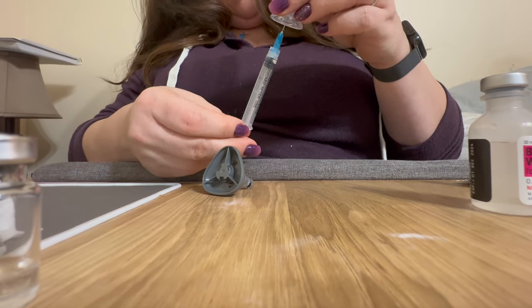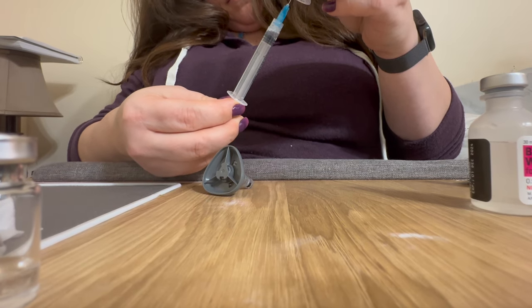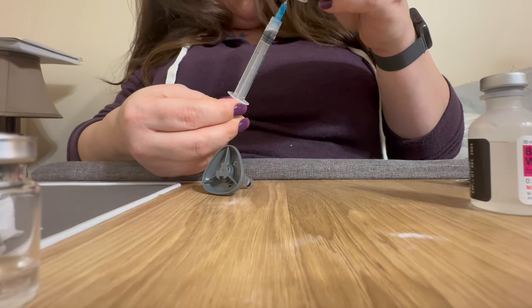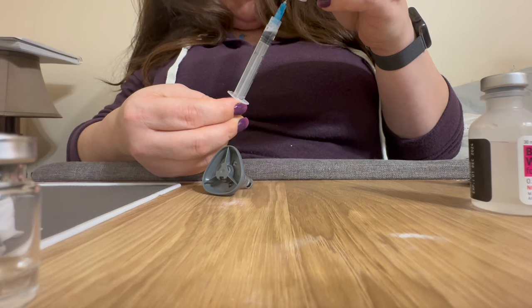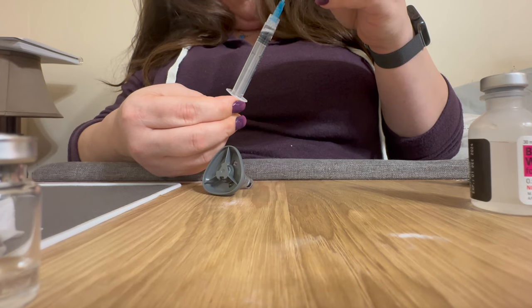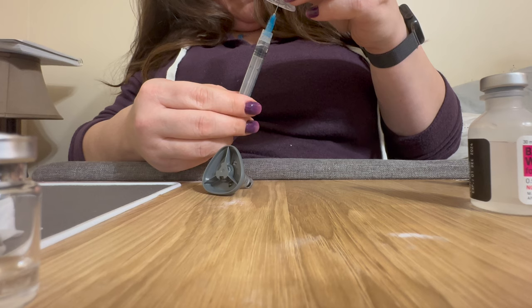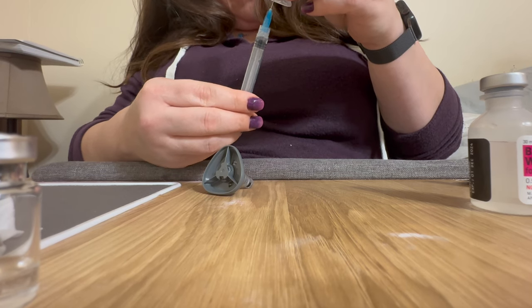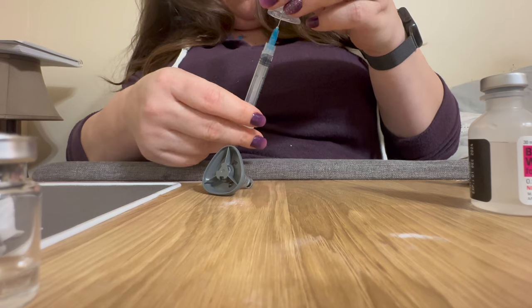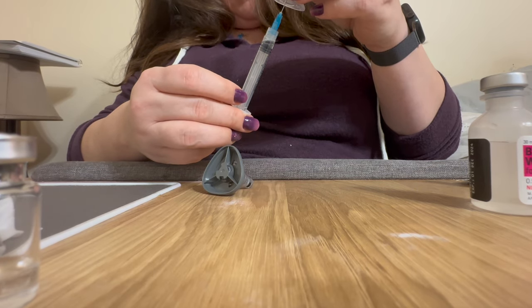If you look really closely into the syringe, you'll be able to see the medication slowly going in there. There might be some bubbles and that's okay. You want to be gentle with this, but it's not a big deal if there are a few bubbles here and there.